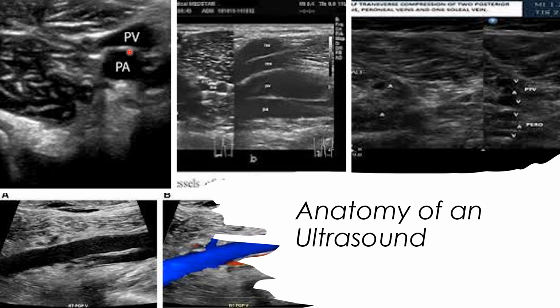Now, as we look at that popliteal vein in long, it should look a little bit something like this. Make sure that you're not popping between the artery and the vein, as that can get confusing. But remember that the artery is going to be pulsatile, the vein should be phasic, and so that should demonstrate the difference if you're a little bit unsure. Now here is the popliteal vein, where we actually see that anterior tibial vein dropping in.